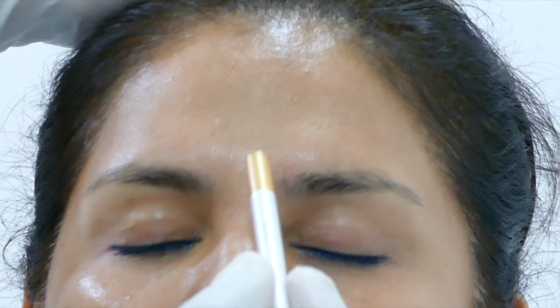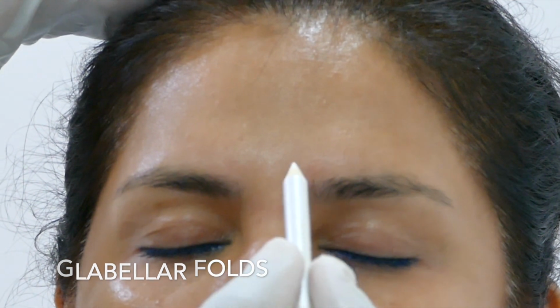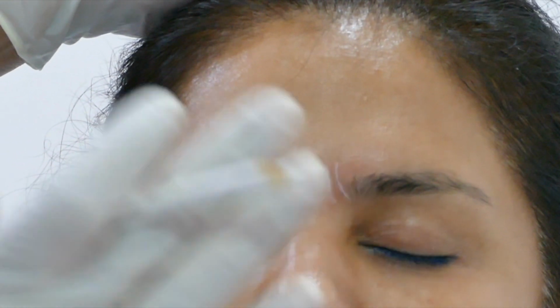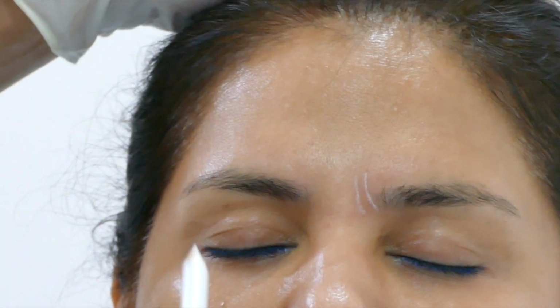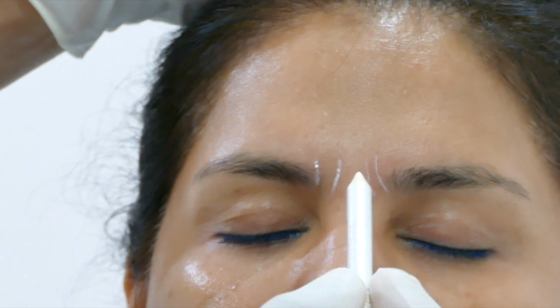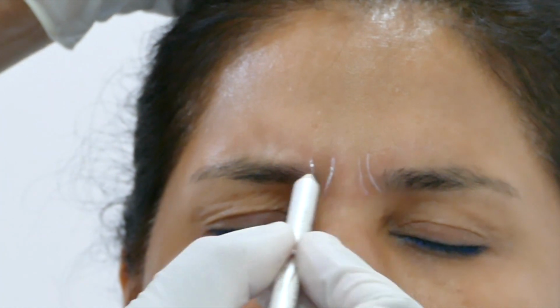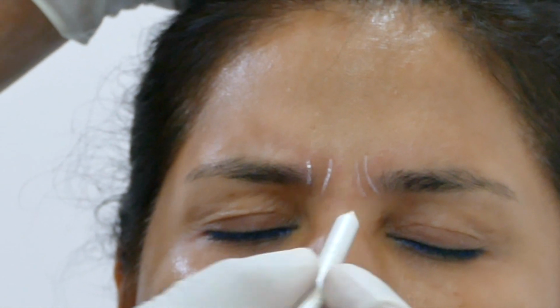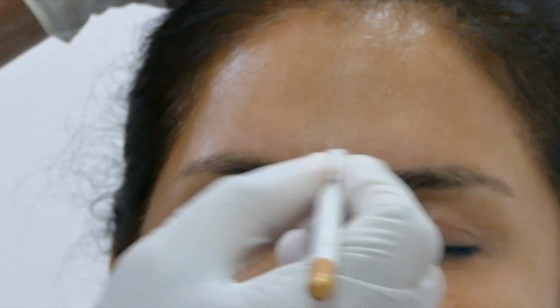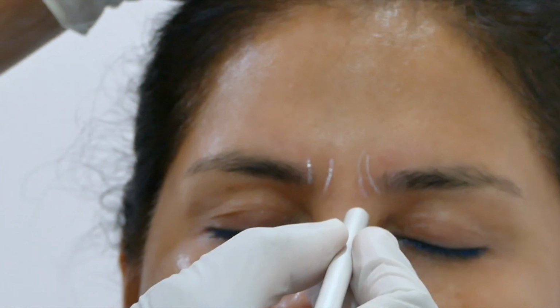Alright, so we're going to work on the glabellar fold. Now if you see, she has a very small depression when she is not animating and a very mild depression here. Now frown, can you frown? When she frowns, this gets deepened. So there are two things that we work on this. One is giving Botox injection to relax the muscle and then to fill glabellar lines.